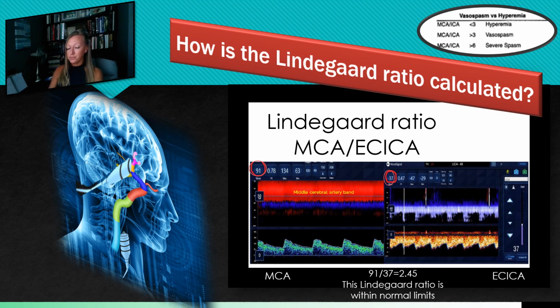post-subarachnoid hemorrhage. So when you look at the screen here, you can see your middle cerebral artery, the mean flow velocity is 91, it's circled here, and that's what we're obtaining here with TCD. And then we're also putting that probe at the submandibular window, and we are getting our extracranial ICA so that we can compare the two.